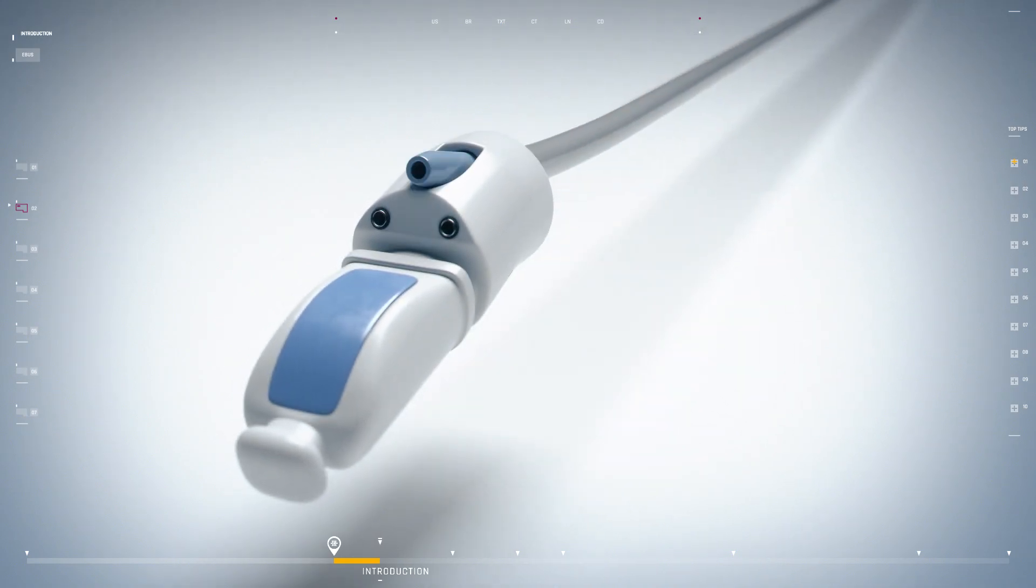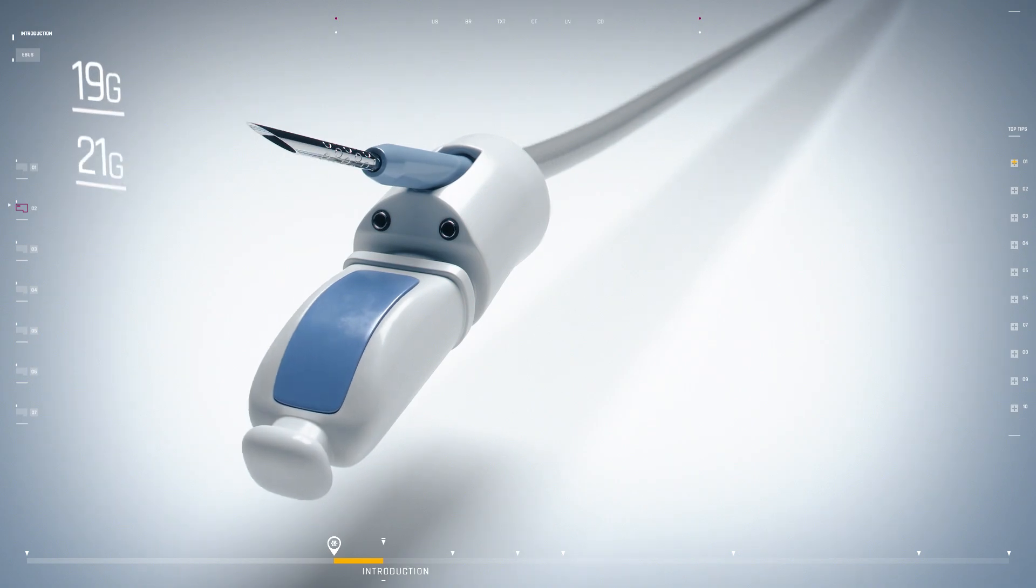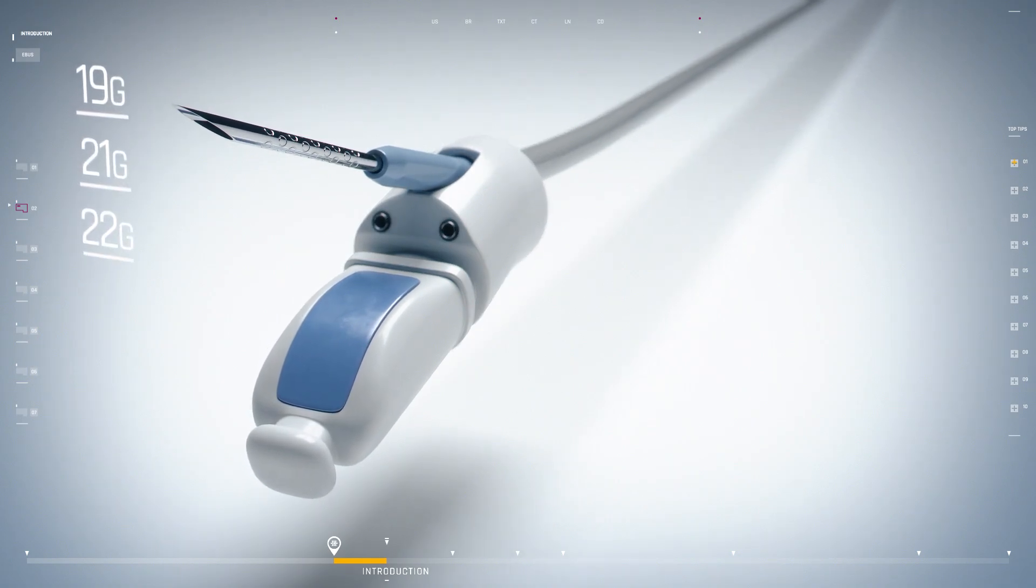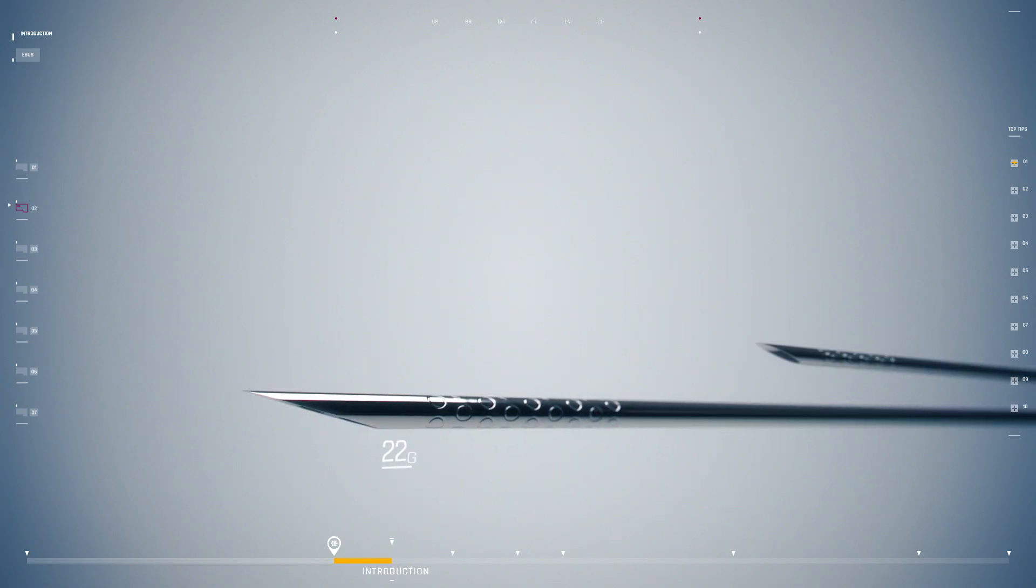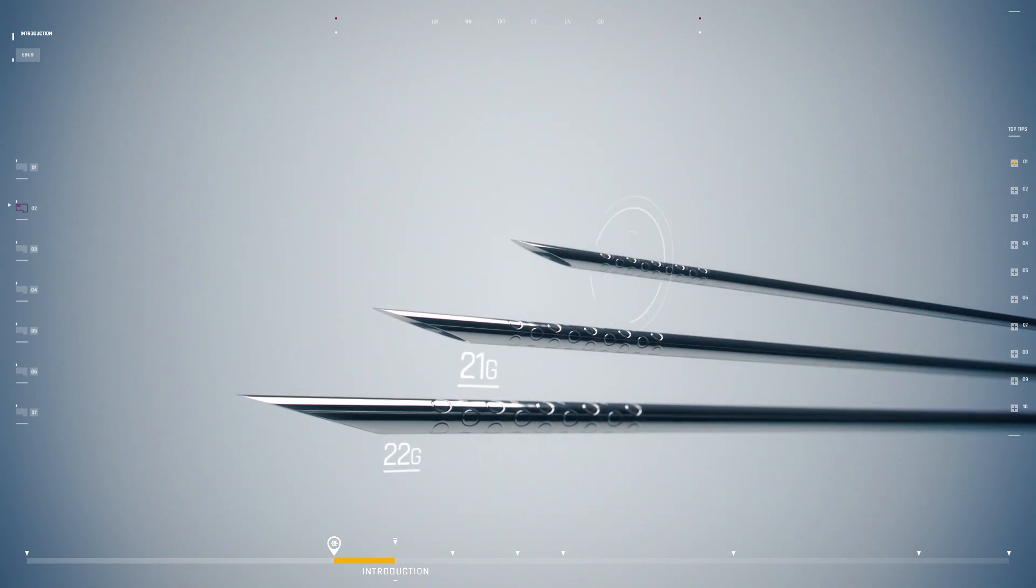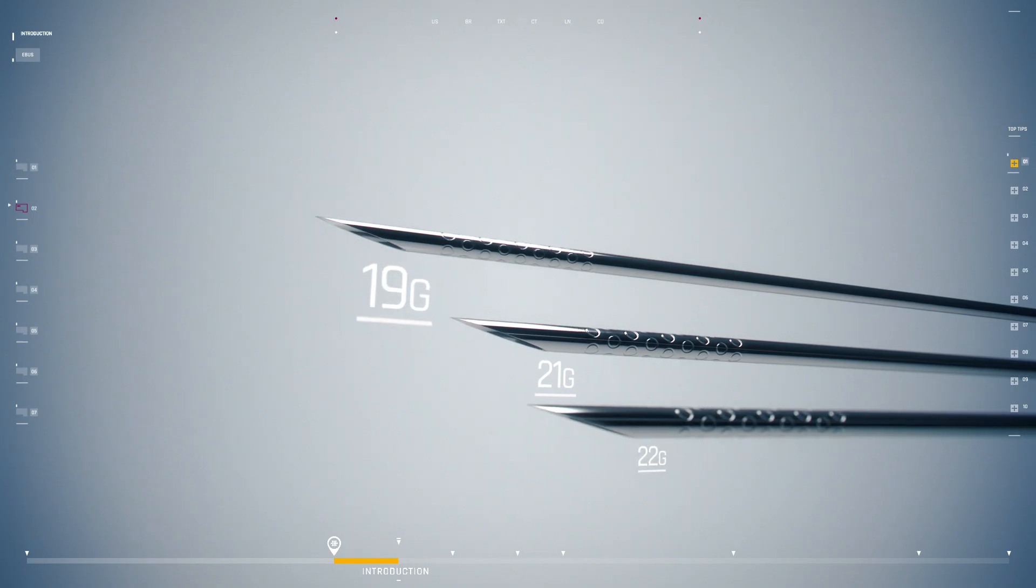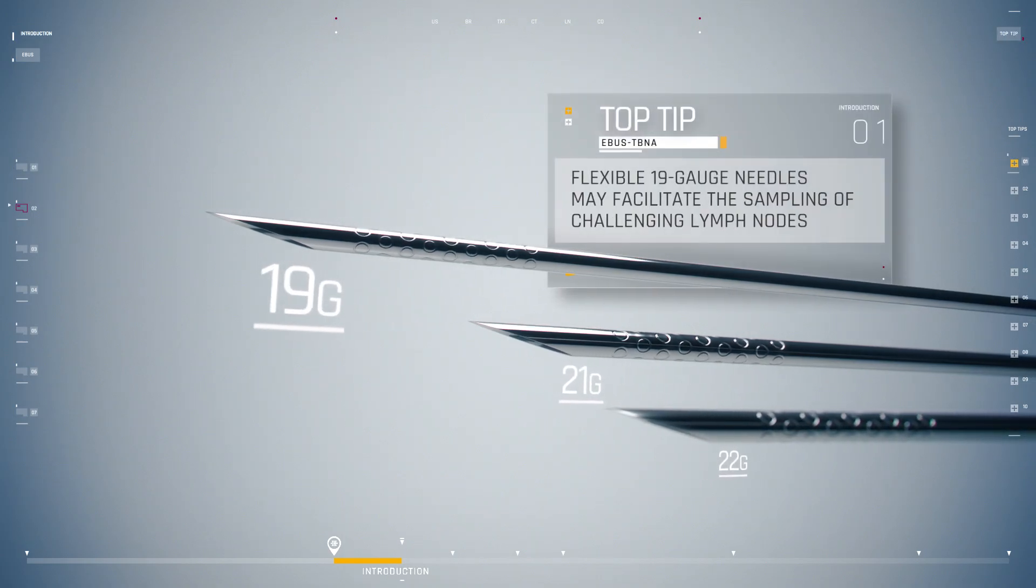The bronchoscope has a working channel that can house a dedicated 19, 21, or 22 gauge needle. Appropriate needle selection will depend on the clinical situation. The 19 gauge needle may be more flexible than other needles and can provide better access to more challenging areas such as station 4L and hilar lymph nodes.